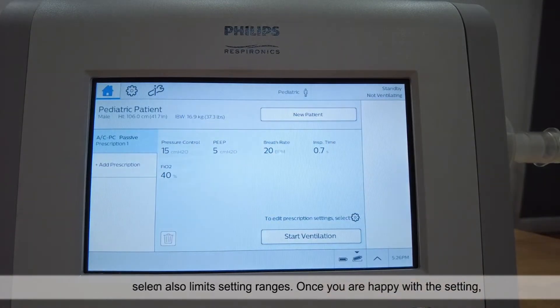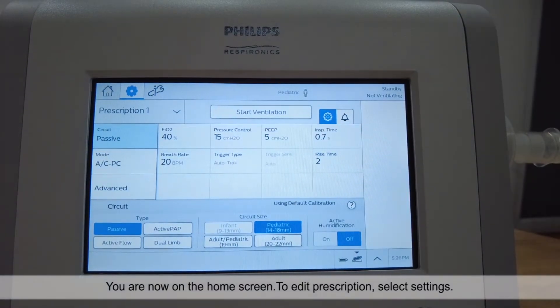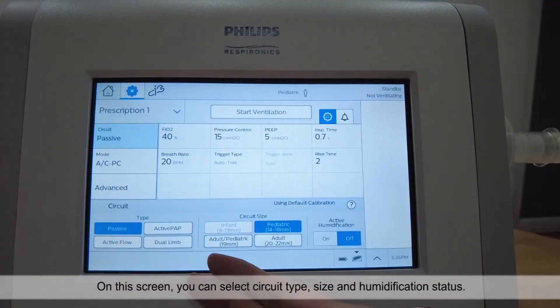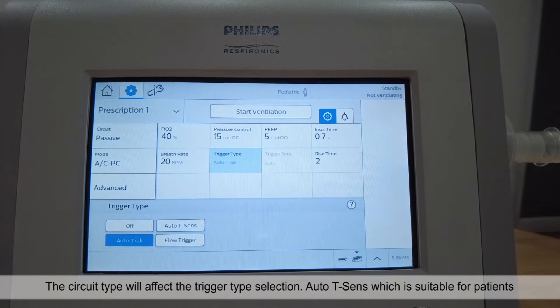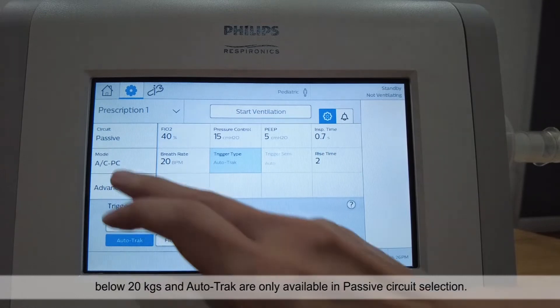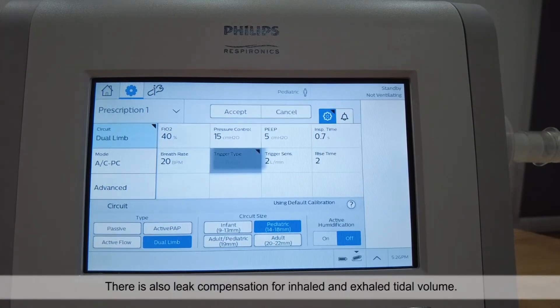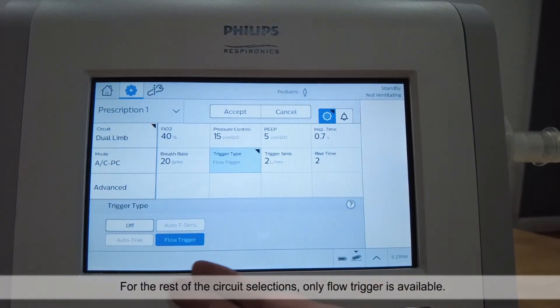Once you are happy with the settings, select accept and ensure a viral bacteria filter is installed. You are now on the home screen. To edit prescription, select settings. On this screen you can select circuit type, size and humidification status. The circuit type will affect the trigger type selection. Auto-T Sense, which is suitable for patients below 20kg, and Auto-Track are only available in passive circuit selection. There is also leak compensation for inhaled and exhaled tidal volume. For the rest of the circuit selections, only flow trigger is available.